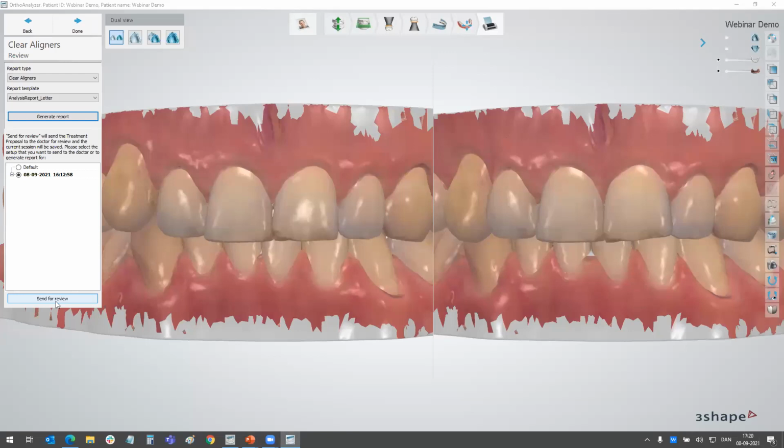And of course, if you have either a previous version of ClearAligner Studio or a previous version of the Premium package, you will also get all of this cool new functionality via your subscription. So both Premium and ClearAligner Studio have the new functionality, and labs will be able to buy ClearAligner Studio at the lower price. Basically they can buy it if they have a scan only, if they already have an Ortho System Premium or want to purchase an Ortho System Premium, or Ortho Analyzer.